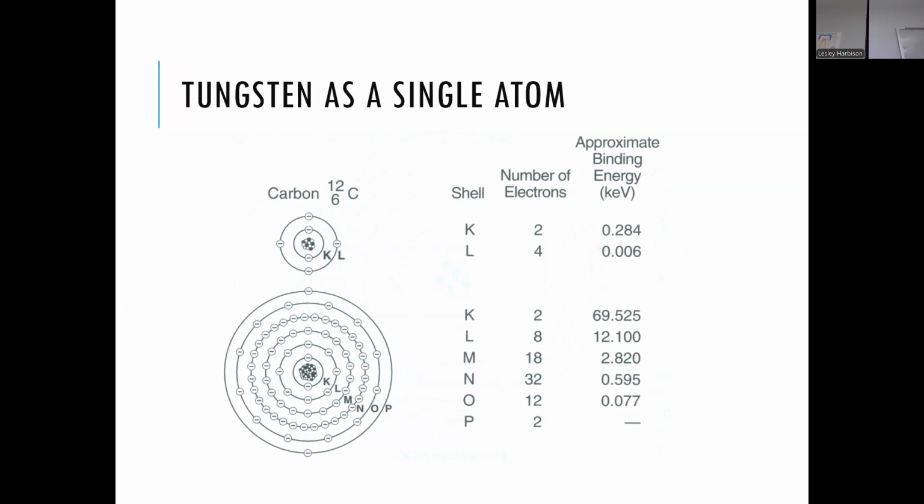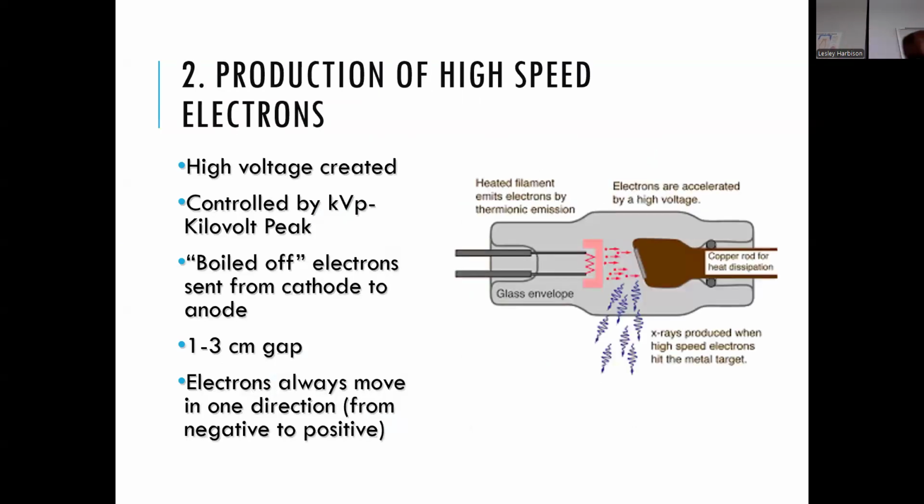So even though it's a solid metal filament that you could pick up and look at, the electrons are becoming available on this very tiny atom level of the metal. So that's just to remind you that that's where this process is occurring. Other than that, this slide you don't have to memorize. There's letters and numbers and valences, and I don't want that to make you think you have to memorize anything there.